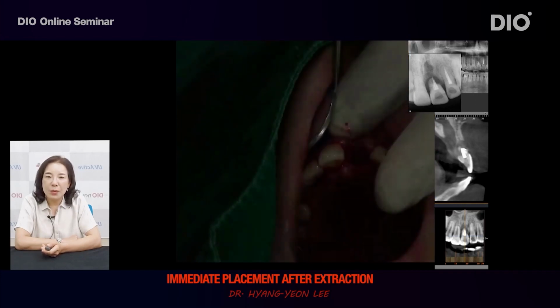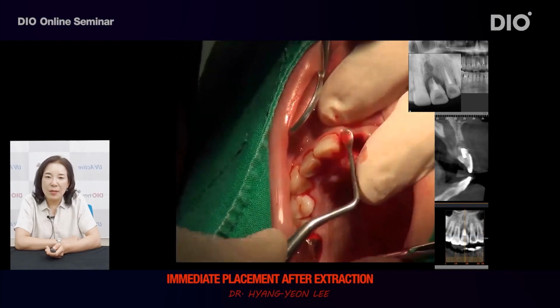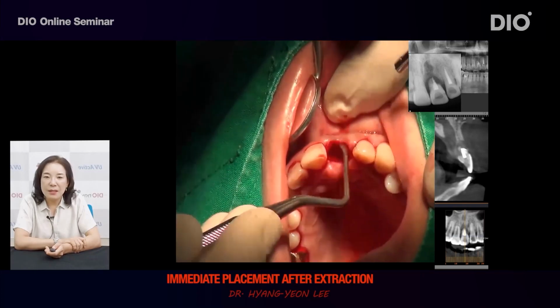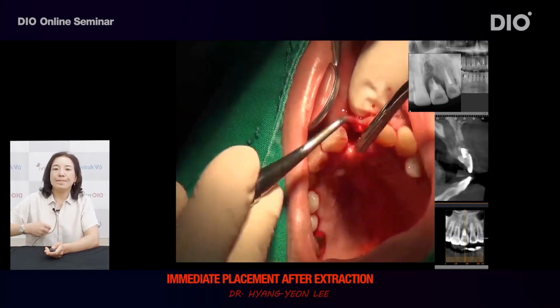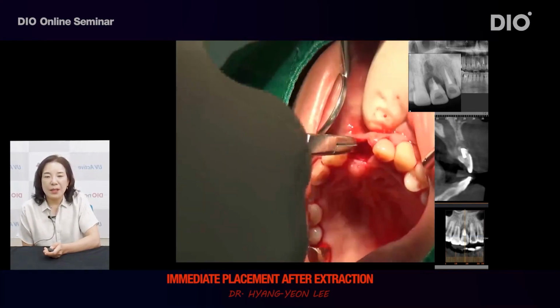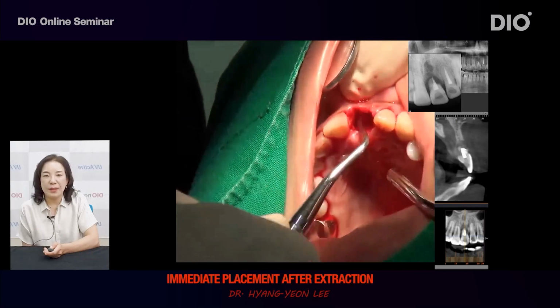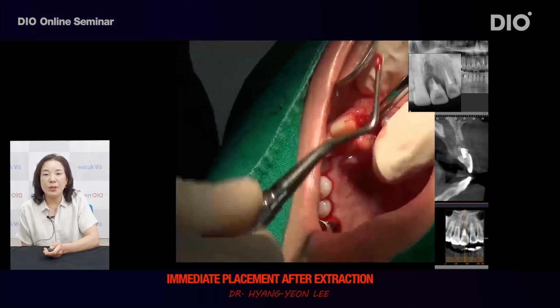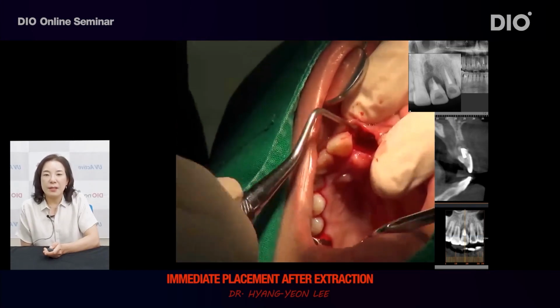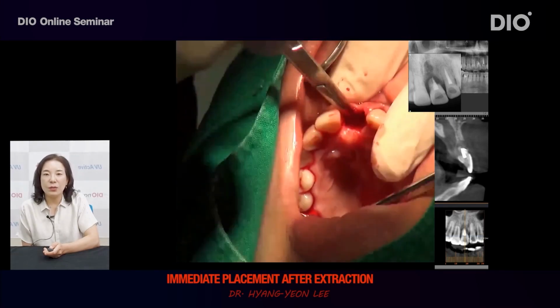However, what is important is that you will be able to see the gum without the attachment of bone due to full absorption of bone on the buccal side if you look there. If the gum on the buccal side is removed due to the presence of inflammation, the immediate placement after extraction will fail. You must never remove the gum. You need to thoroughly remove only the inflammation tissues in the tooth extraction socket while leaving the gum on the buccal side intact. There is no bone at all in that section.